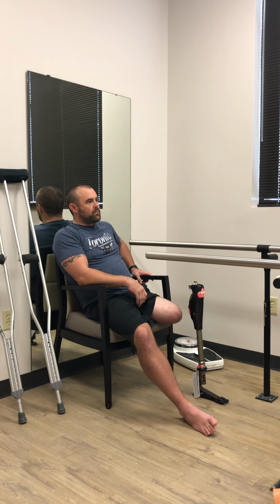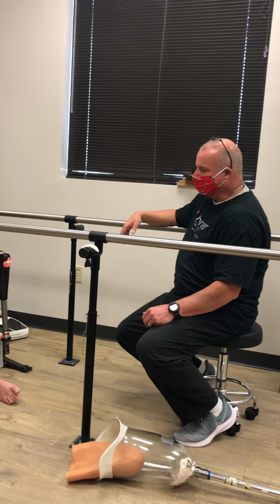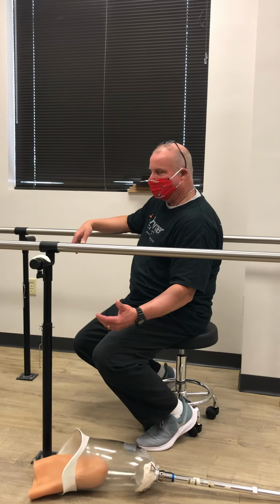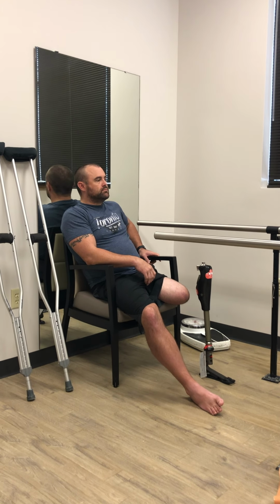If you're a highly diaphoretic amputee, unfortunately, you might have to take the leg off and take the liner off and dry your skin and dry the liner and put it back on. And that's going to be one of those inconveniences where you go, okay, that sucks. Does it happen? It does.